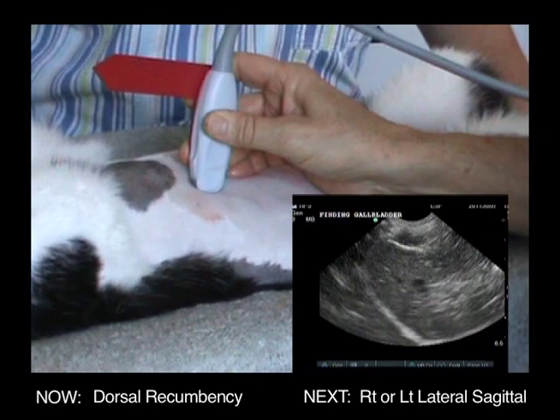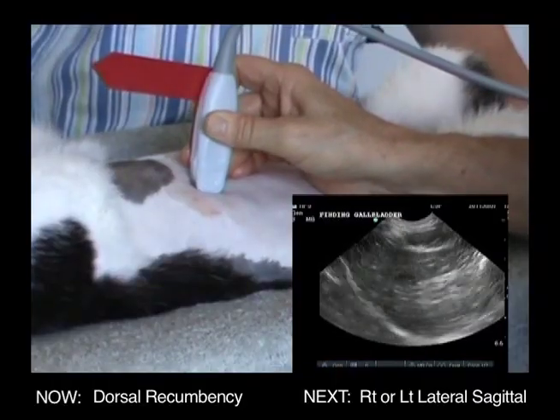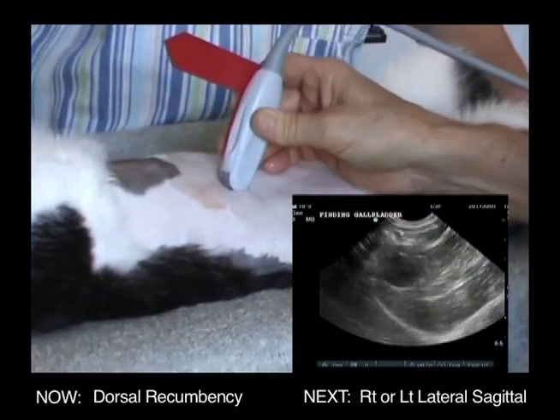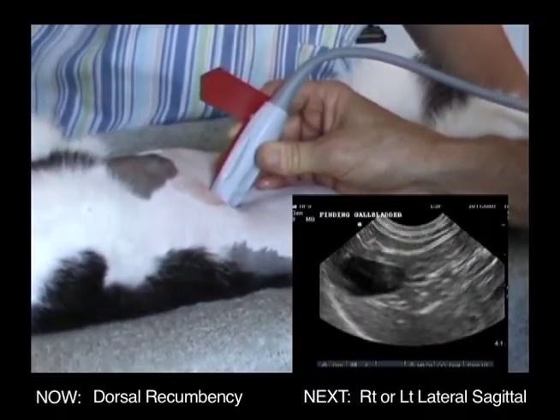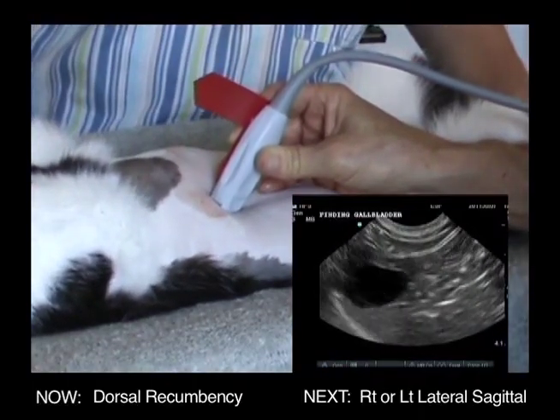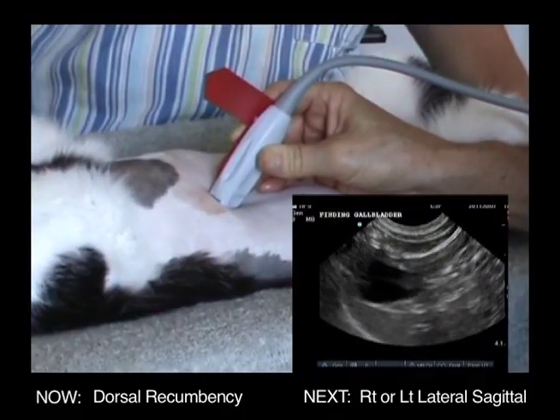Fan the transducer to the patient's right side to find the gallbladder. If necessary, rotate the transducer clockwise or counterclockwise to find the long axis of the gallbladder. If necessary, slide the transducer along the rib to the patient's right side. Decrease depth to magnify the gallbladder for study. Decrease gain in the area of the gallbladder to reduce artifact. If needed, apply pressure to the transducer to get it closer to the gallbladder for a better image.